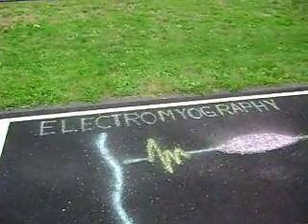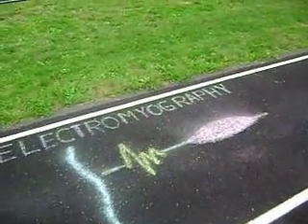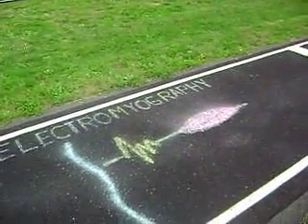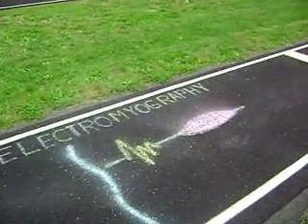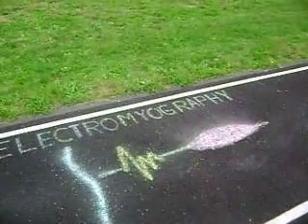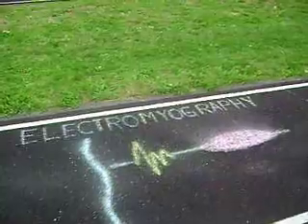The F wave latency is prolonged in neuropathies with proximal involvement such as Guillain-Barré syndrome and diabetic neuropathy. It is also prolonged in radiculopathy, some hereditary neuropathies, and motor neuron disease.